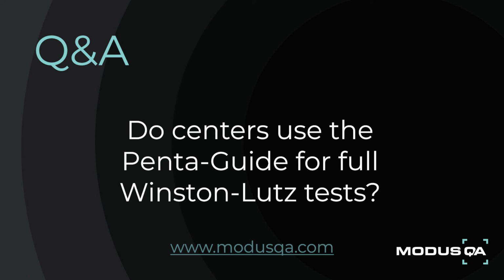But we do have another dedicated wand that can actually perform the Winston-Lutz testing to a more detailed view of your alignment. So I just want to point out that the projection images that the Phantom is designed to handle are from a 0 degree or a 270 degree orientation. We don't have the ring and sphere locations for every degree angle.